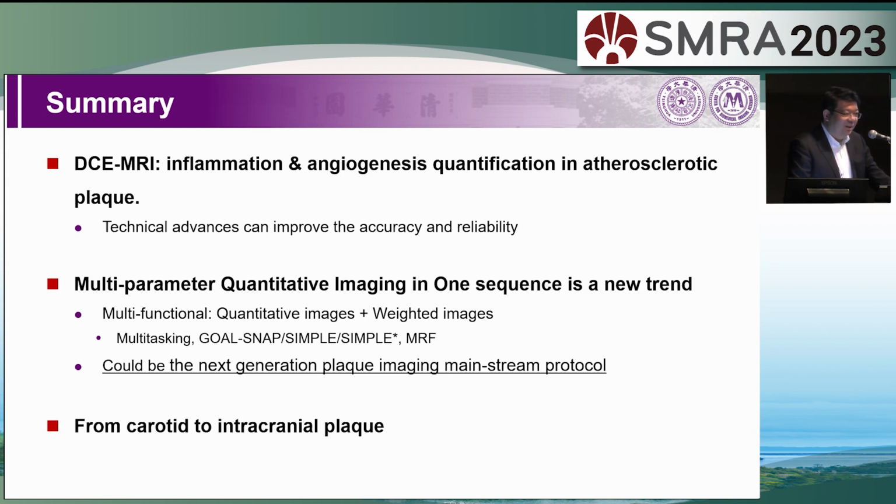Probably MRF can also be used. And this could be the next generation plaque imaging mainstream protocol because it's simple and the scan time is shorter, and it's suitable for post-processing because there is no misregistration among them.